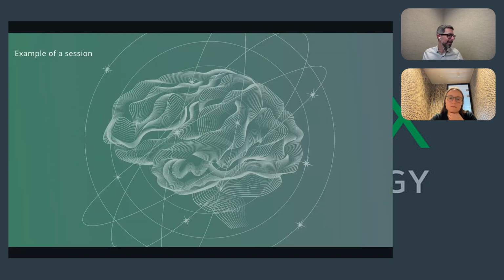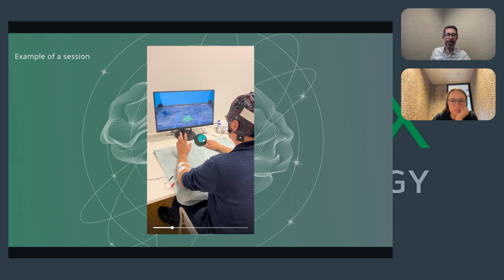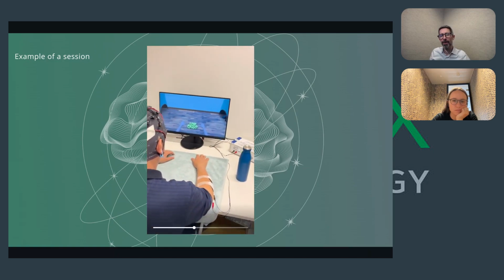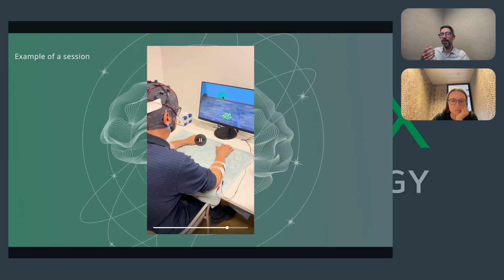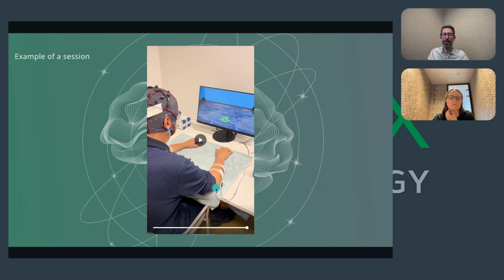And I think we also have some input from life experience. We've taken the liberty of filming how this actually happens in our clinic when patients come in. And here, Mélanie will show you. This is a patient sitting in front of the screen. You see the electrodes on the arms and the headset on the head, both arms fully cabled with 2 electrodes on each arm. After the person receives the command to lift the left or the right arm, the person is not actually helping the arm to lift. The person is just imagining the movement.